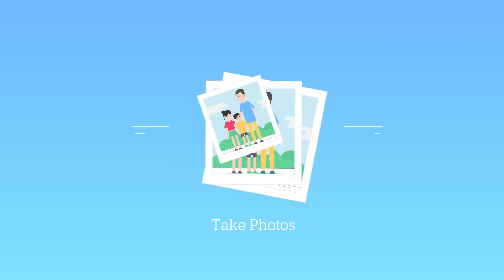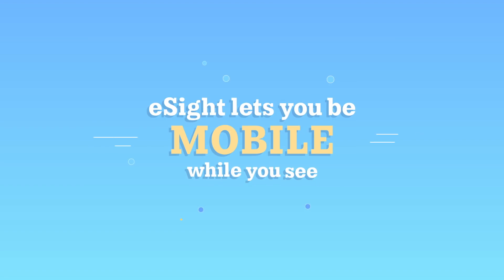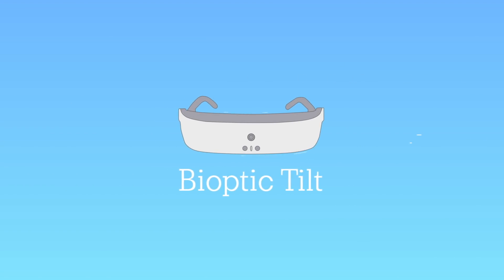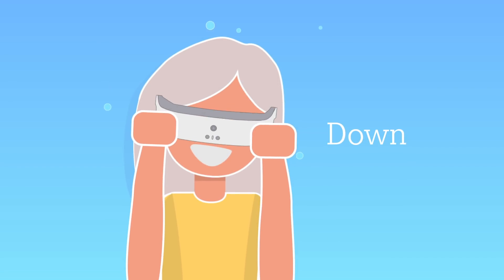With eSight, you can even take photos and stream other content directly to the screens in front of your eyes. Unlike other assistive devices, eSight lets you be completely mobile while you see. With eSight's bioptic tilt, you always have access to your native peripheral vision, tilting up, down, and midway. eSight — glasses that let the visually impaired see.